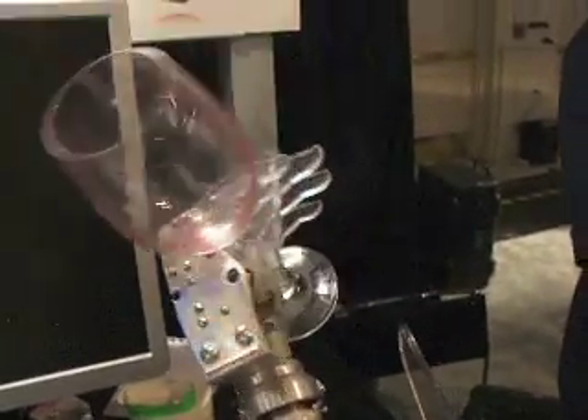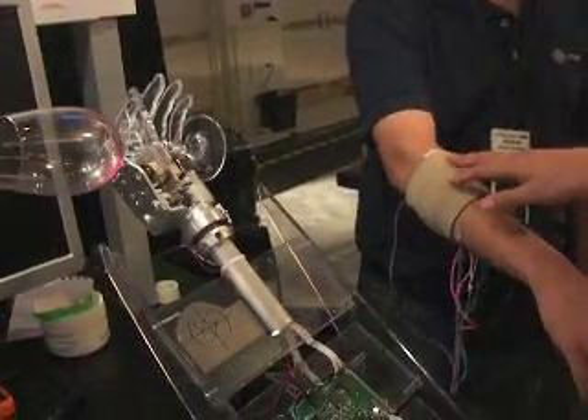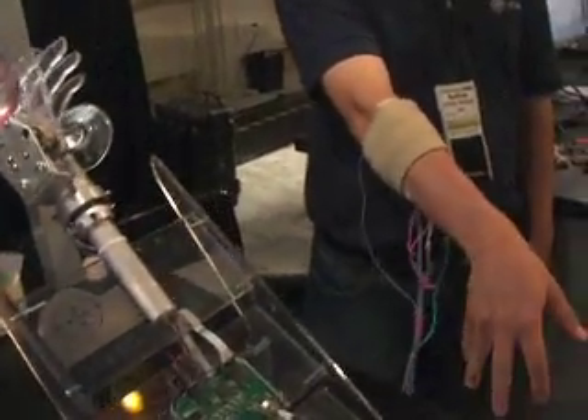This is an electrical hand prosthesis. It's controlled by the movement — the muscle movement in the forearm — with single electrodes.